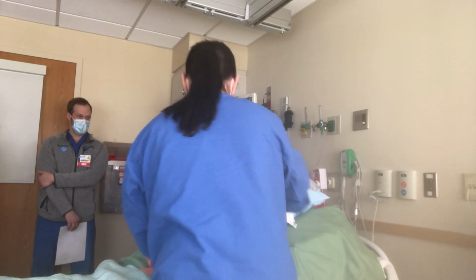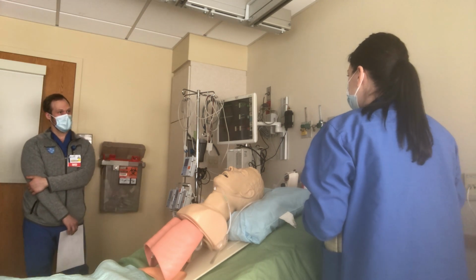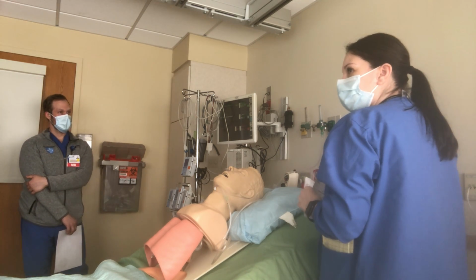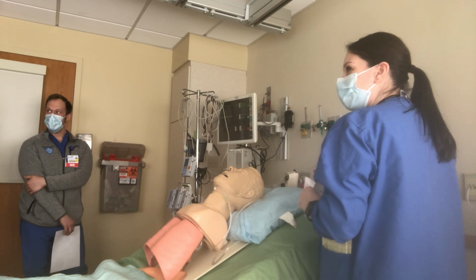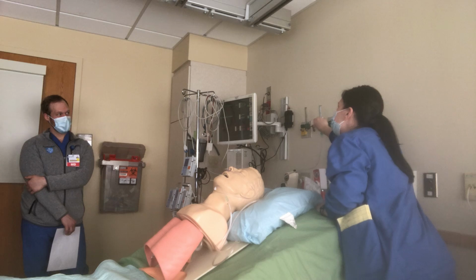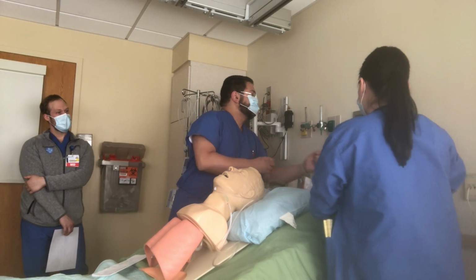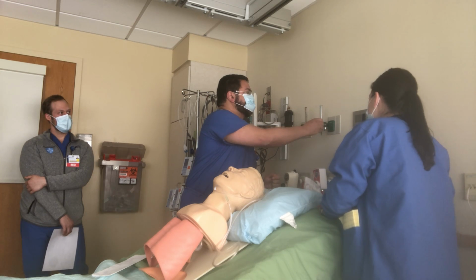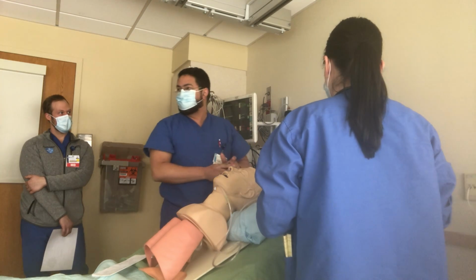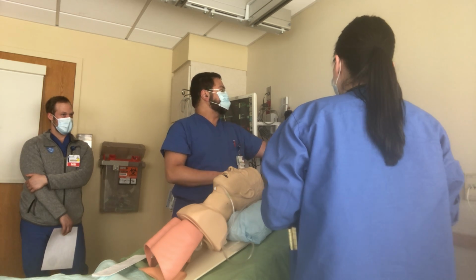What do you set the nasal cannula at, Courtney? Go to 2 and keep going up. No, 10. Take no prisoners. Just flush it. I want everybody to hear this, okay? So this is the sound of a 15-liter nasal cannula, right? And that's the max that's written here, 15.